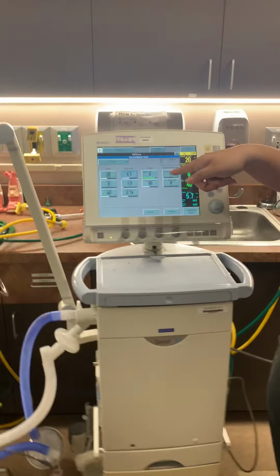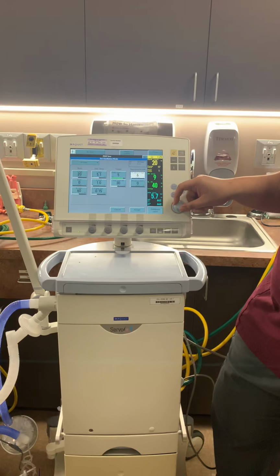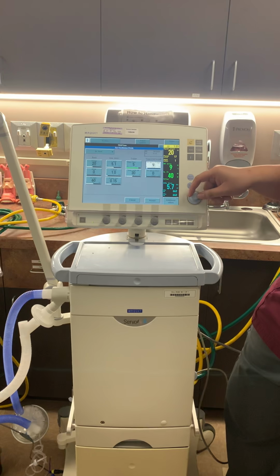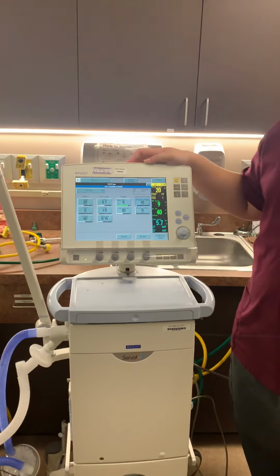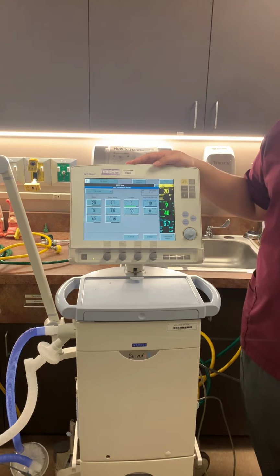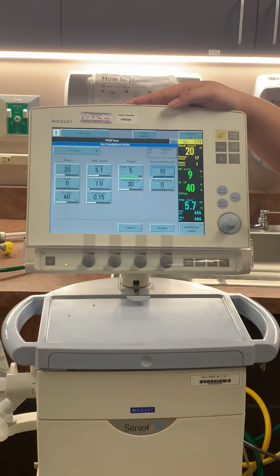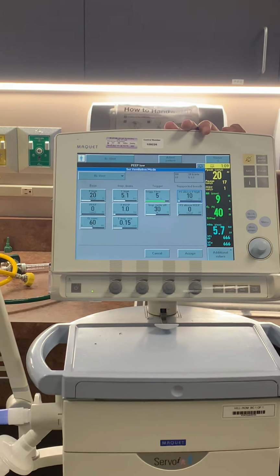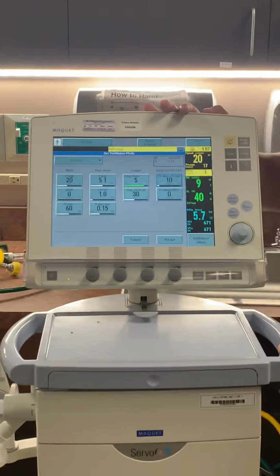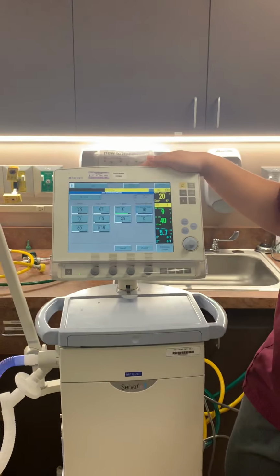So you can pressure support to P high. You can set that to just like your normal pressure support, and pressure support above PEEP. You're not really going to be touching that because your PEEP is going to be 0. Notice how I've said PEEP is going to be 0 a lot of times. It's almost like that's going to be on the exam. It will be on the Boards? Boards maybe, definitely this exam.